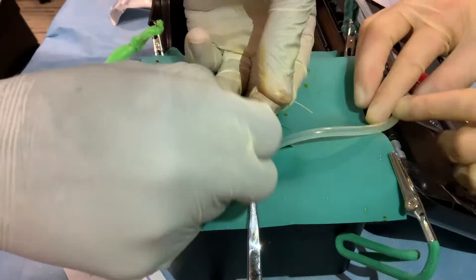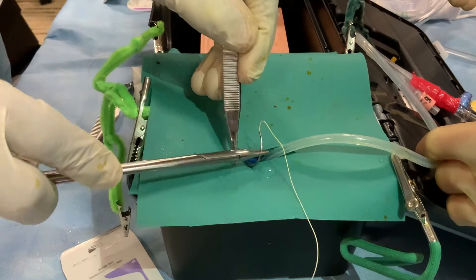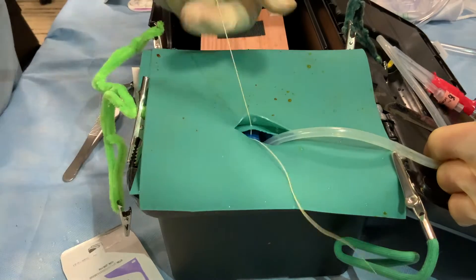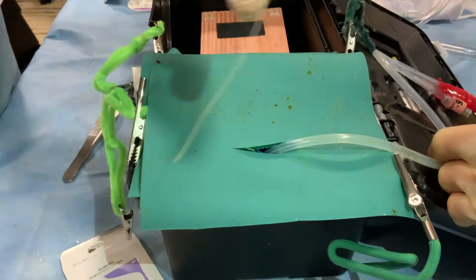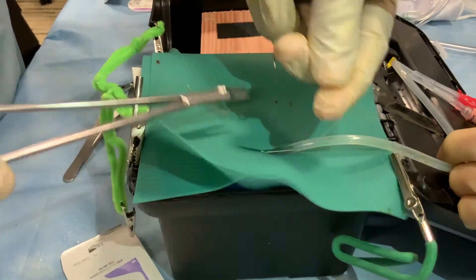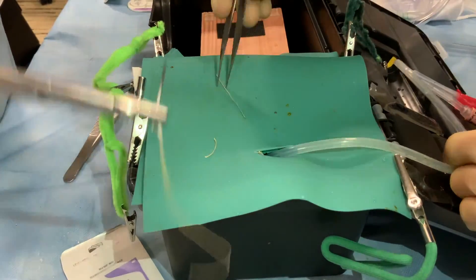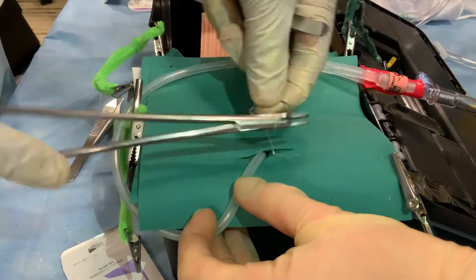This process is repeated with the other stay suture. Now that the Foley is secure, the surgeon proceeds to close in layers. First, the rectus muscle and the subcutaneous tissue are closed with interrupted sutures, taking care not to stitch through the lumen of the Foley. This is done on both sides of the catheter. Approximately 2-3 stitches should be placed on either side, approximately 1 cm apart.